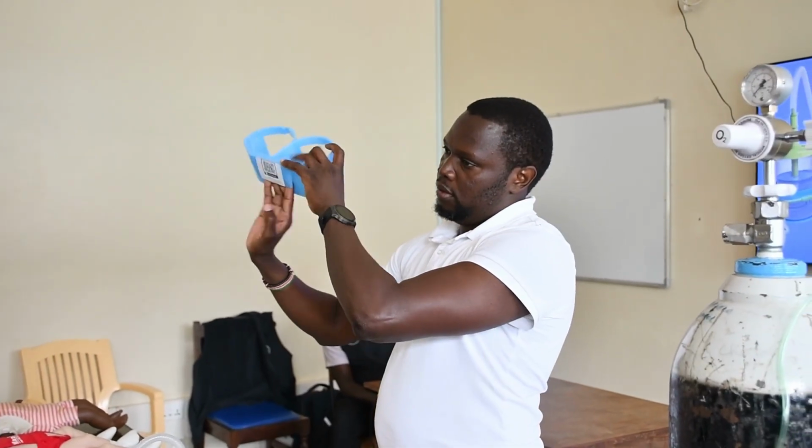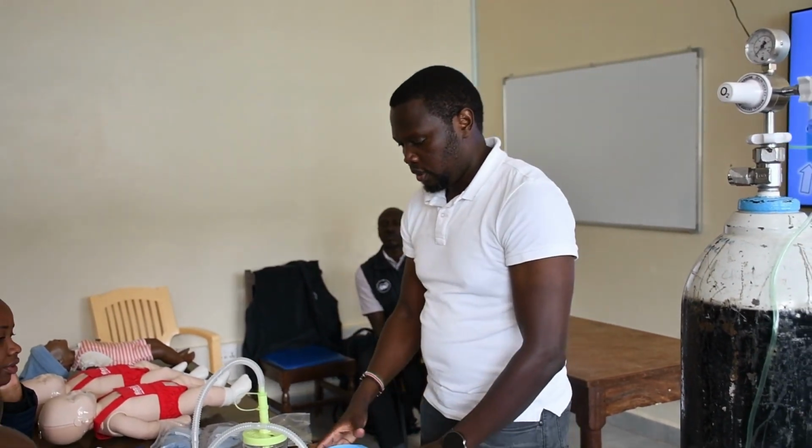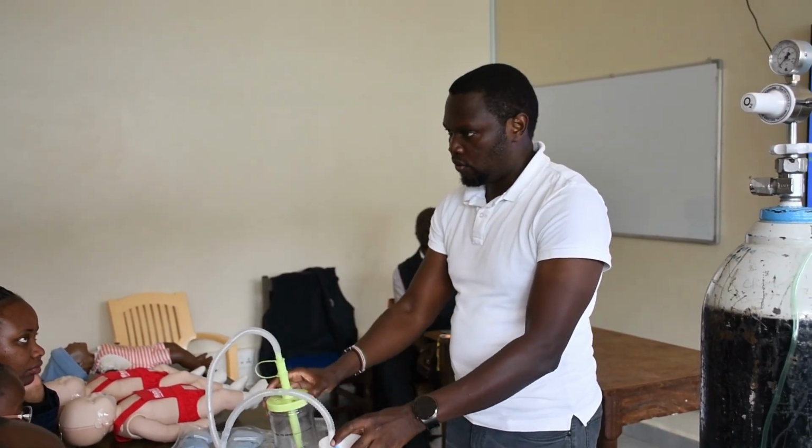That theory has changed a little bit because we find that in most public facilities where we work, they don't have warmers. But when you have a warmer, you can easily put this on the warmer side. So that's why it's called a warmer bracket. But the main function is to hold the entire system together.